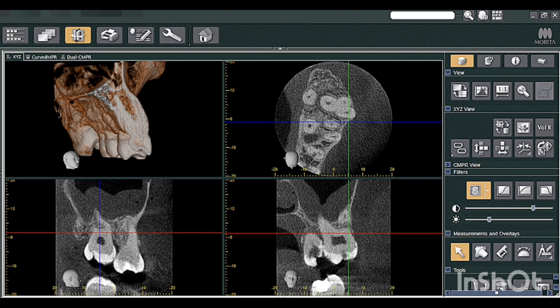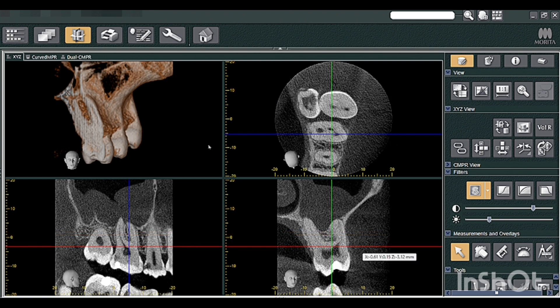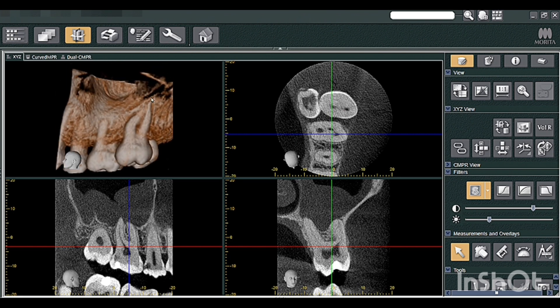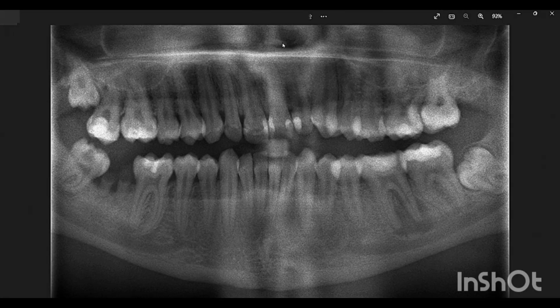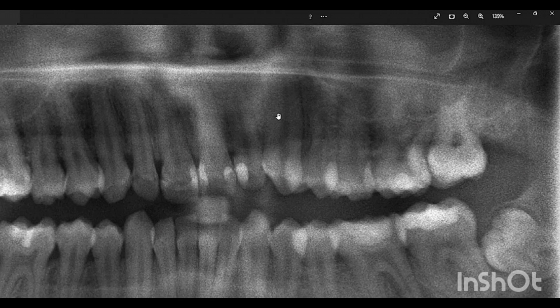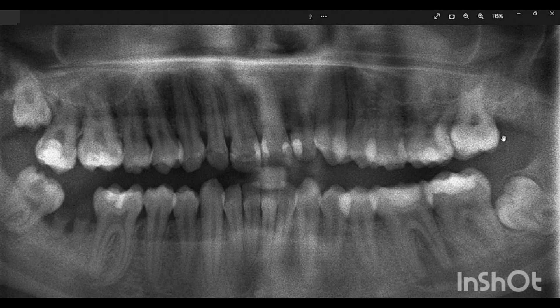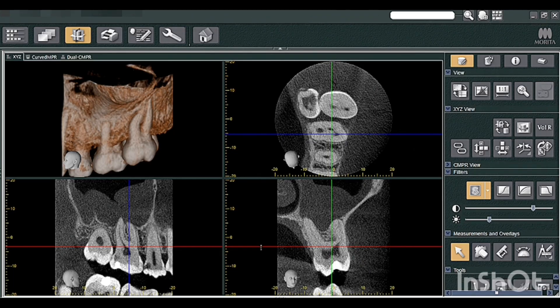We'll view it along the long axis of the tooth. This is the second molar, this is the first molar, and this is the buccal aspect. Now have a close look at the panoramic image. Our area of concern is the second quadrant, that is the 26-27 region. When you look at the panoramic image, you can easily make out there's no impacted tooth visible — canine, premolars, first molar, second molar — and the third molar is not visible. Hence in such cases it is always recommended to use a 3D modality, that is CBCT.